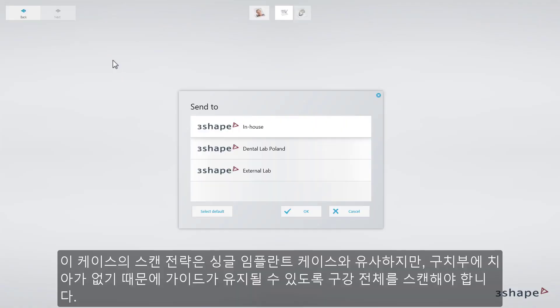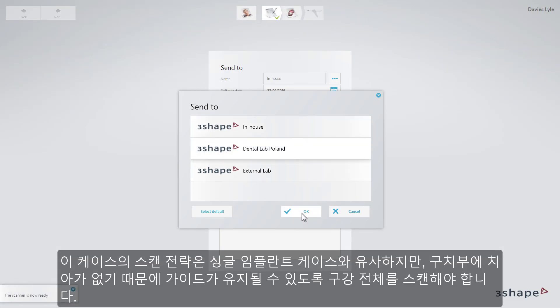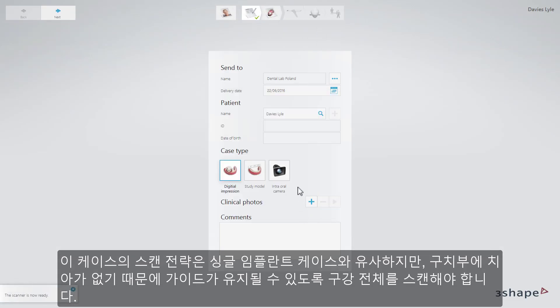The scan strategy for this case is similar to a single implant case. However, we need to scan the full mouth to be able to retain the guide, due to the absence of the posterior teeth.